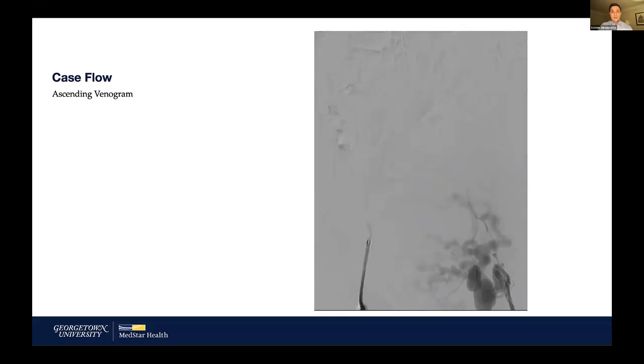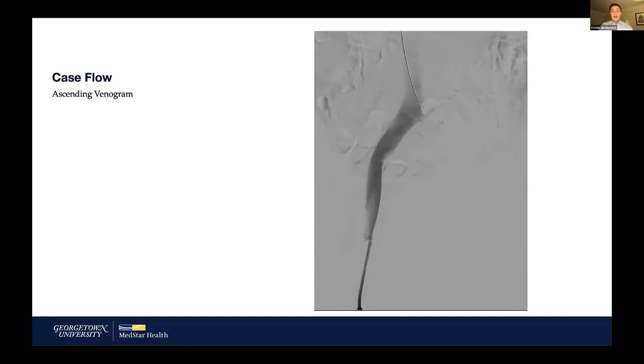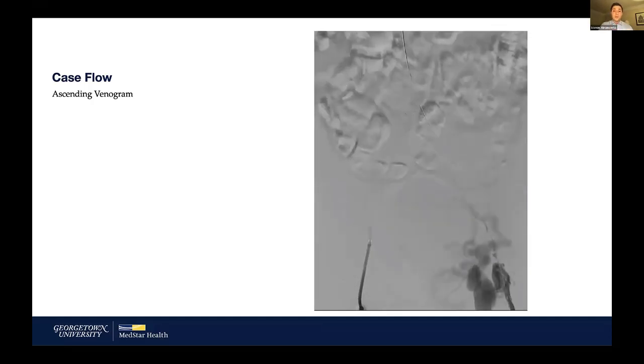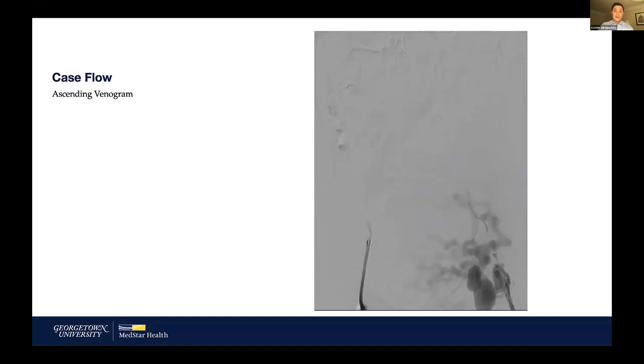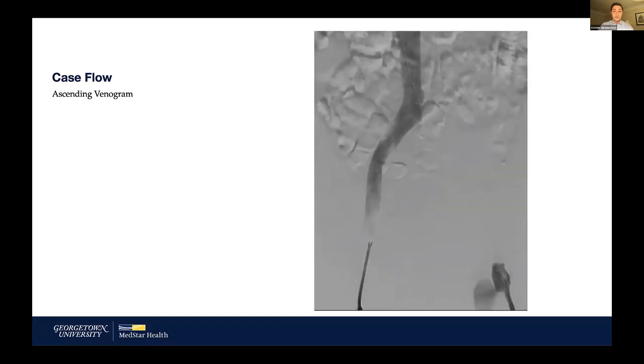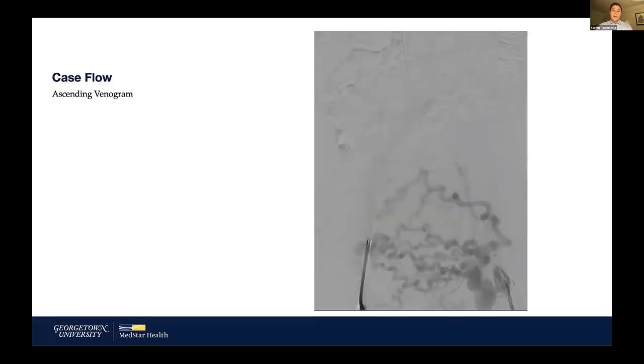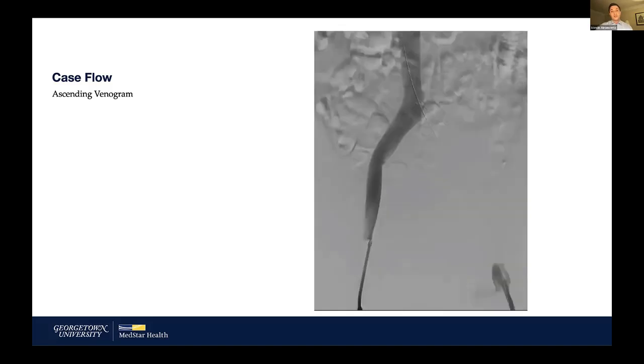Having contralateral access for my first case was very helpful in allowing me to visualize flow within the Protrieve sheath. I was concerned that if the stent remained occluded, I wouldn't be able to visualize what was happening in the IVC. Additionally, if I had to extend my stent into the IVC, I had access to create kissing stents or a two-in-one stent. We did our ascending venogram, crossed our lesion, and then the next step was to get all additional access.